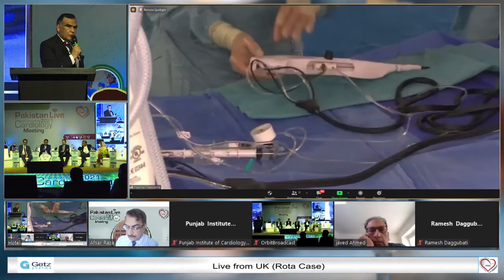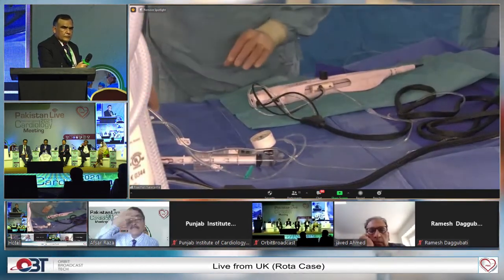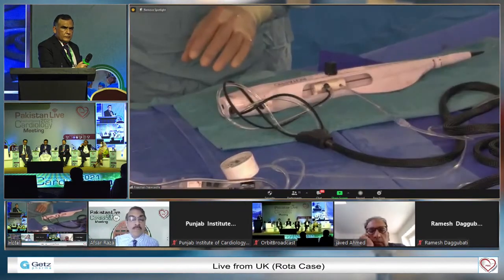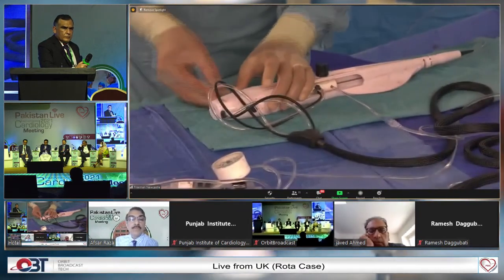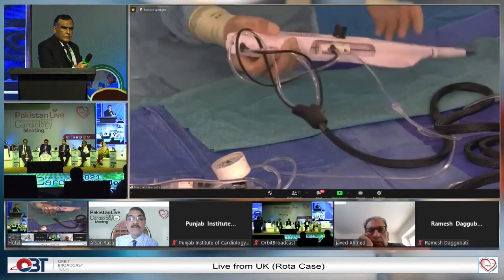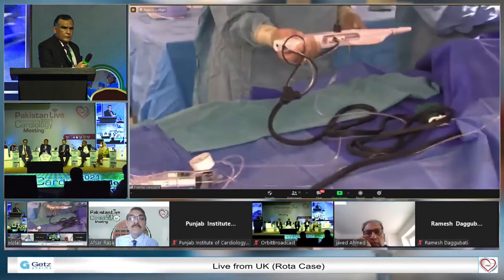Okay, just 1 second. This is your Rota Pro. Yeah, this is the Rota Pro. As I said, now DynaGlide. I DynaGlide my burrs up without any problems. Okay, off you go. I often even don't screen because you don't need to, everything is stable.